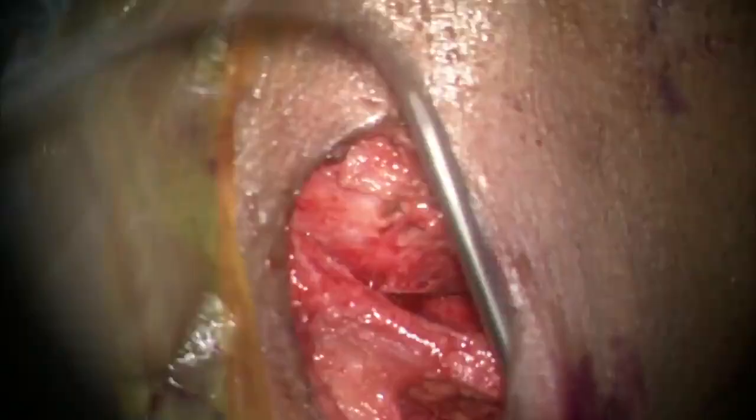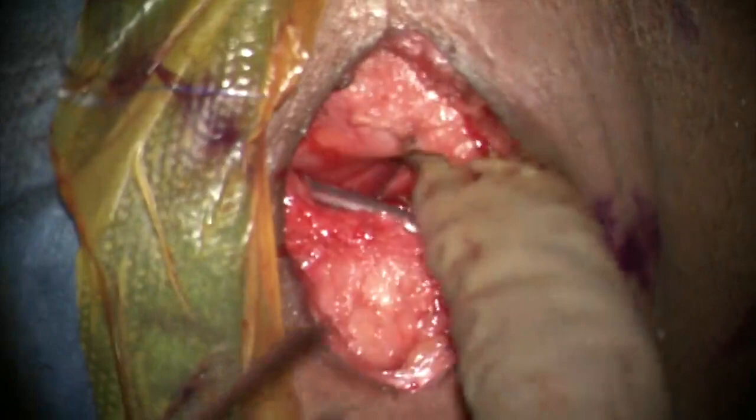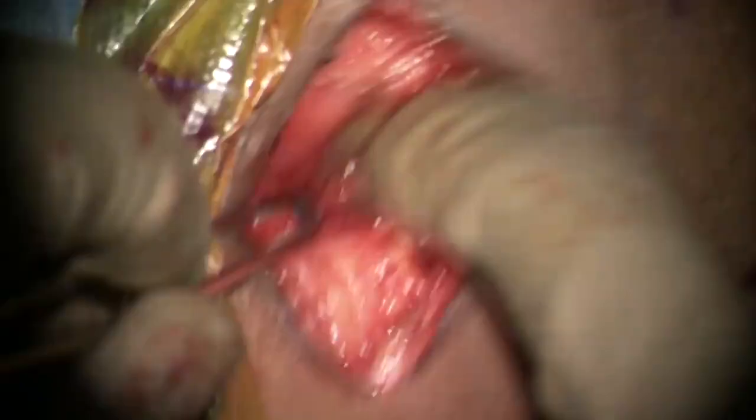Following a thorough wash, the viscera is inspected and a drain is placed into the prevertebral space. The platysma is closed with interrupted absorbable sutures and a subcuticular stitch is taken for the skin. An appropriate dressing is applied and this concludes our video.